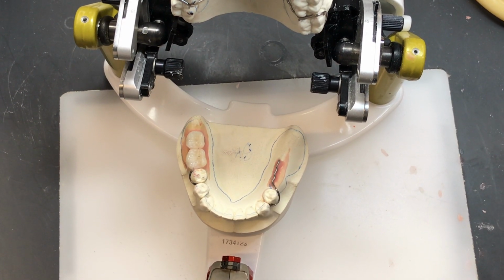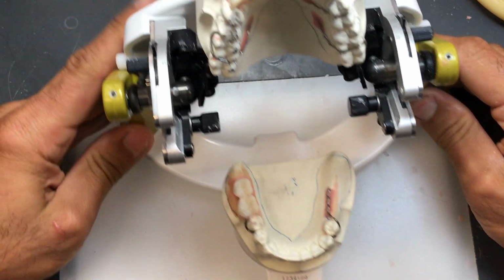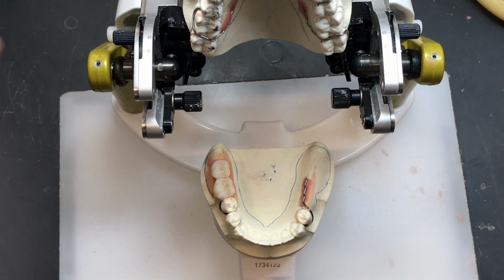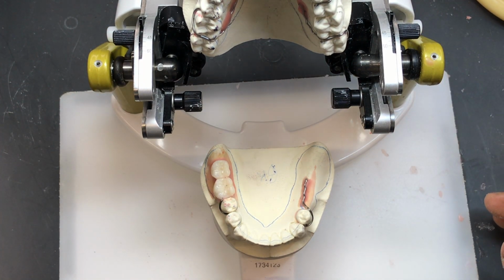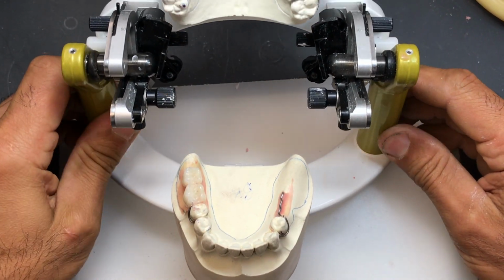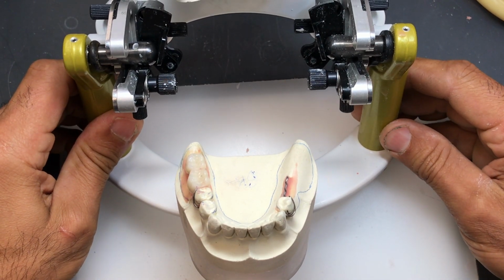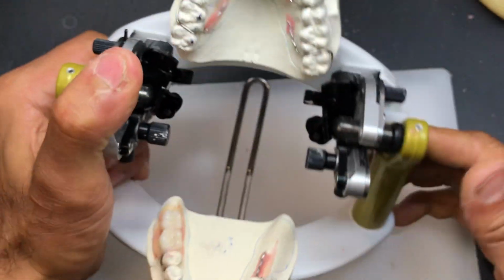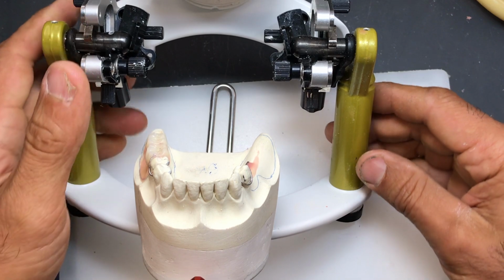Okay, we're going to continue with the lower posteriors. I did one side already, as you can see there, just to speed things up a little bit. But the process is the same, whether you do one side or the other. Okay, I'll show you how to start things off.